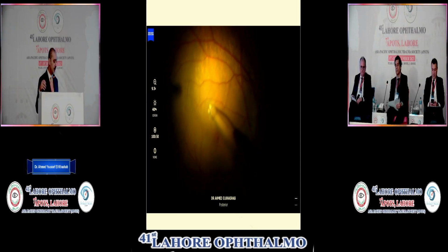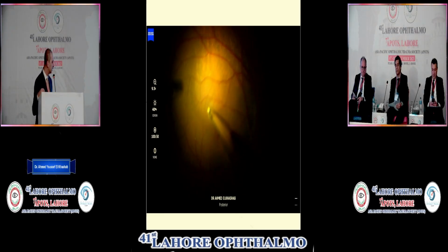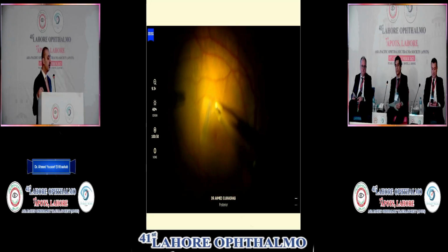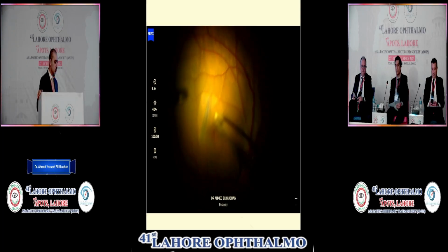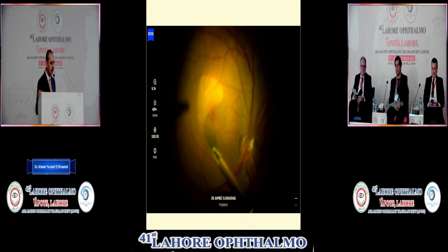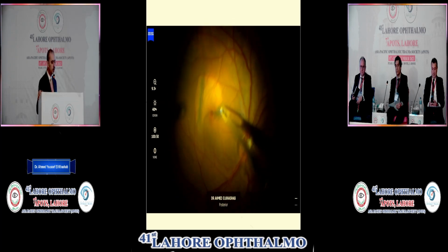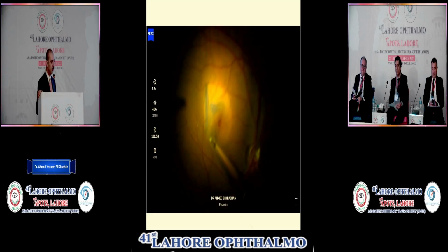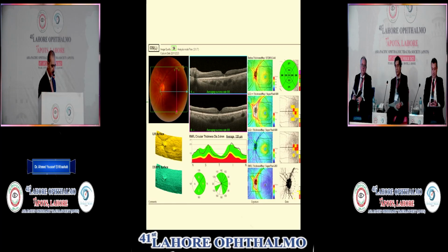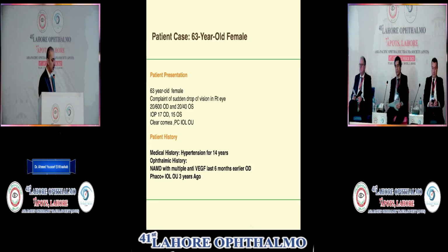That's the simplest technique, and actually gives the best result in visual acuity in such cases. You do not need to do an ILM flap in such cases. Just peel the ILM all around. Do not do excessive pinching of the ILM. Whenever you have a flap, just go ahead with it and continue your peel. That's more than enough. And this is the post-op image. We can reach 20/20 or 20/25 in most of our cases.